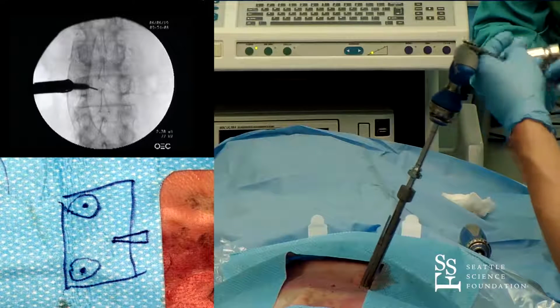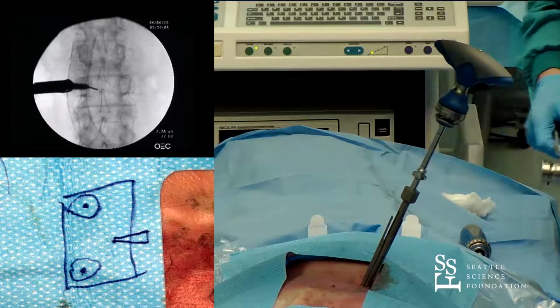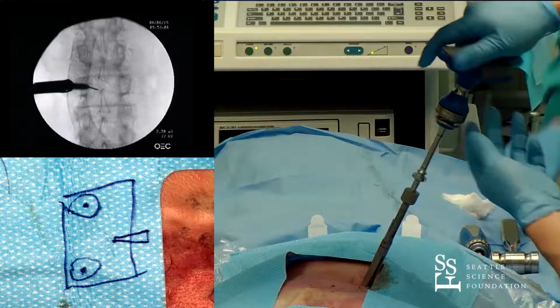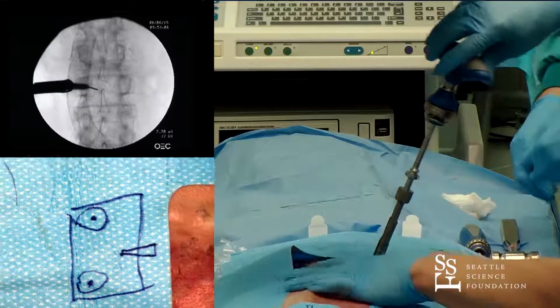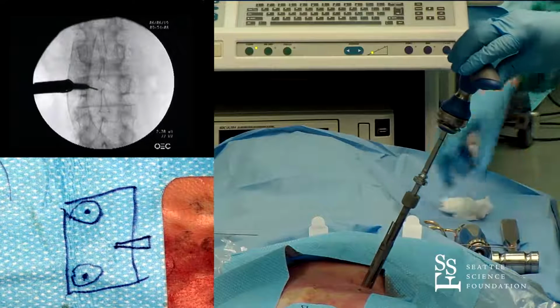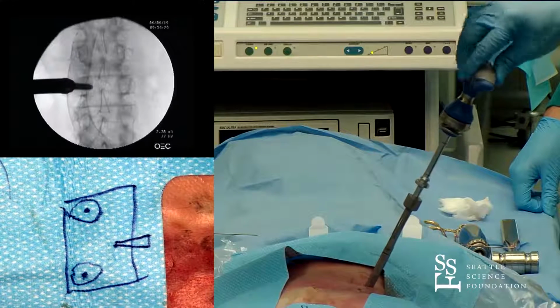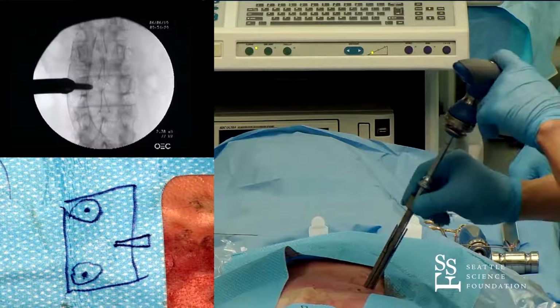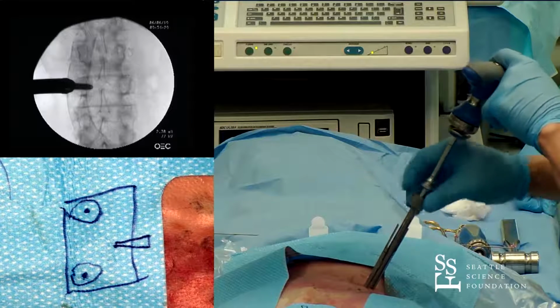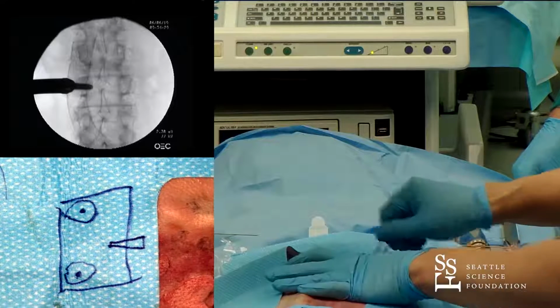Now, at some point, you want to remove this guide wire. So even though we're working in one plane, you have to be cognizant of the other plane. You don't want to penetrate the vertebral body because in front there's vessels. Shot. Good. And there's always these sleeves. Oh, this is really nice. There's sleeves to really help you cannulate.